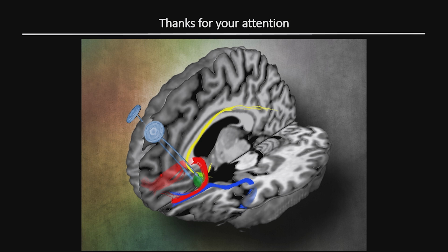That's a very good question, and it really depends on the patient. Some patients showed a very narrow, just one spot around the ALIC. In some other patients, it showed a broad, very big region around the ALIC. In that case, it requires some anatomical limitation or restriction.